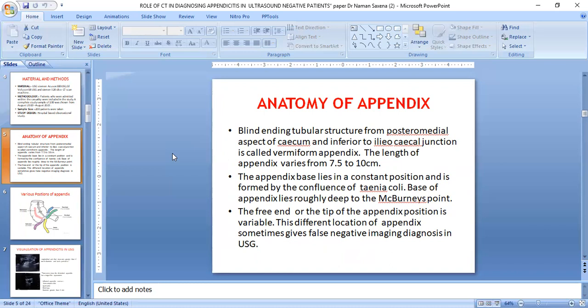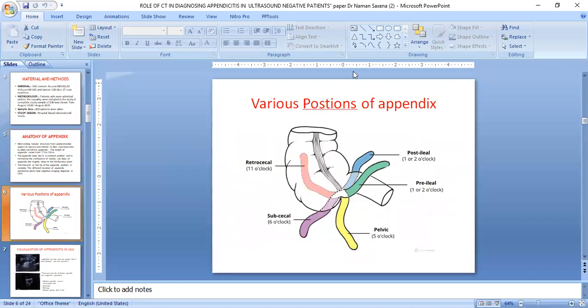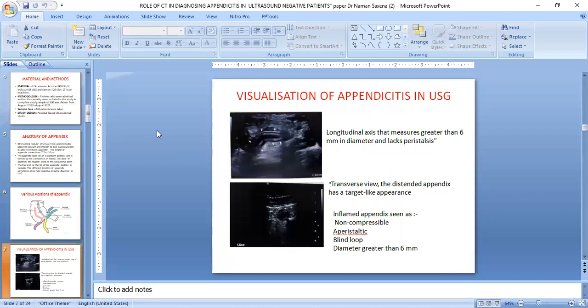The free tip of the appendix is variable in position, and different locations of the appendix sometimes pose challenges for imaging, particularly on ultrasound. The various positions of the appendix include retrocecal, paracolic, subcecal, pelvic, preileal, and postileal. The most common position missed on ultrasound is the retrocecal position, but it is most easily identified on CT, which provides cross-sectional imaging.